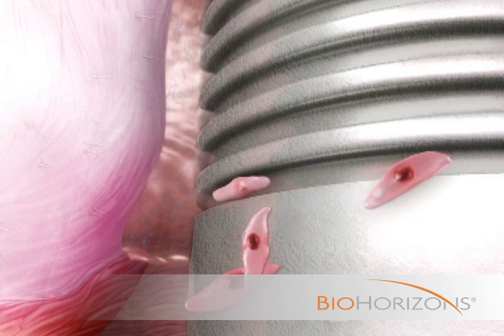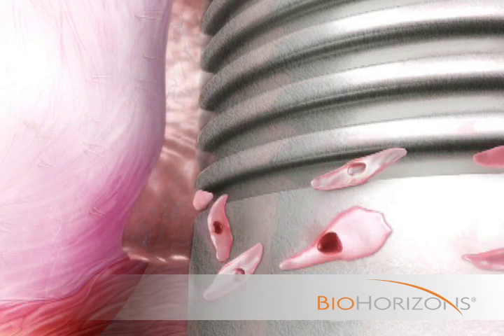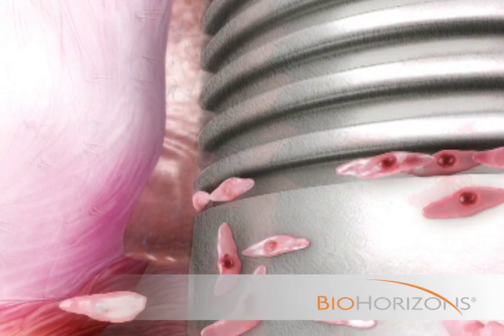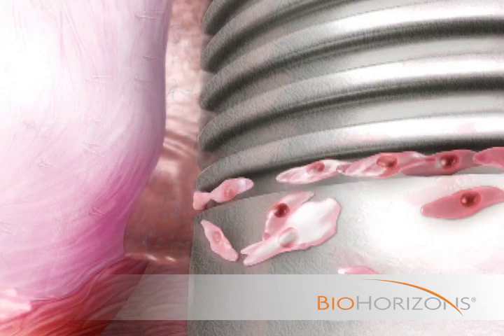During the healing process, epithelial cells are guided into the precisely dimensioned microchannels and firmly attach pseudopodia to the complex nanostructure of the uniform laser lock surface.